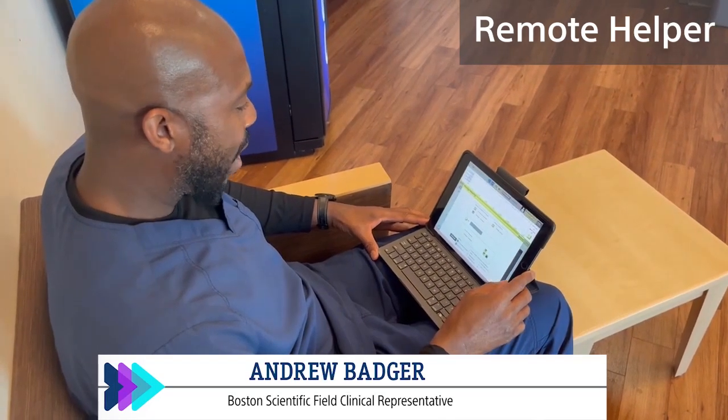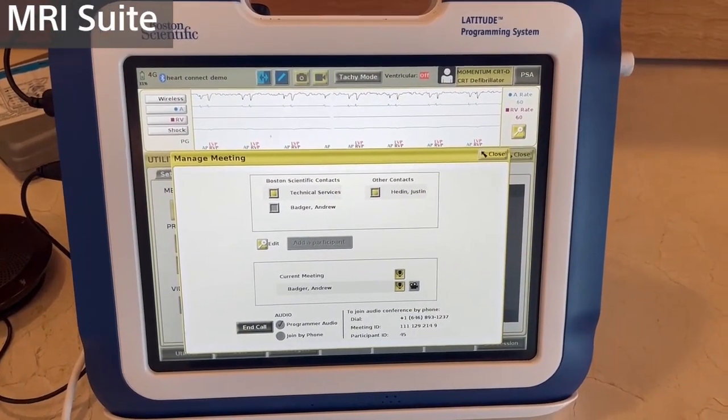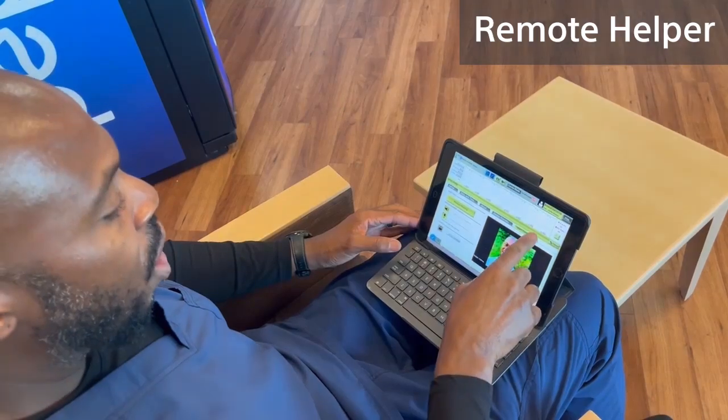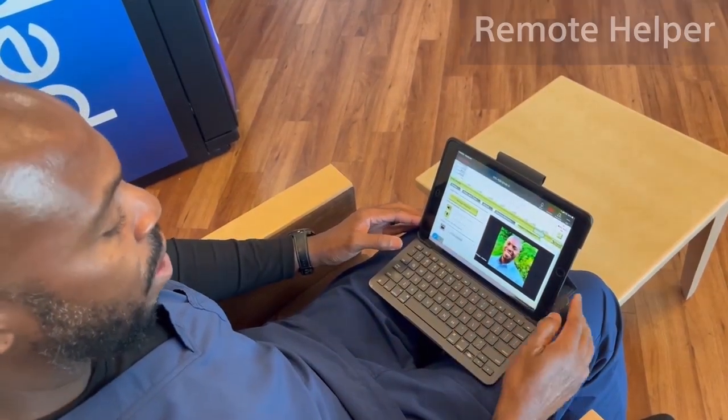Hey guys, it's Andrew with Boston Scientific. How are you doing? Hi Andrew, we've got a patient that's needing an MRI. I was hoping you could help me do some programming. Thanks for calling — I can definitely help you out with that. What I'm going to have you do is toggle through this. Go ahead and go to that close sign right where the arrow is and press close.